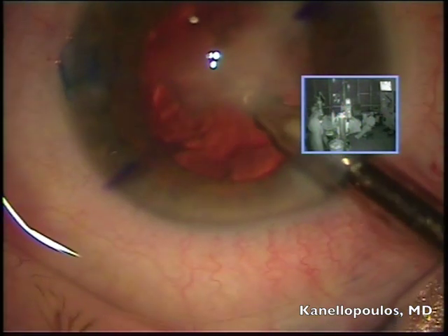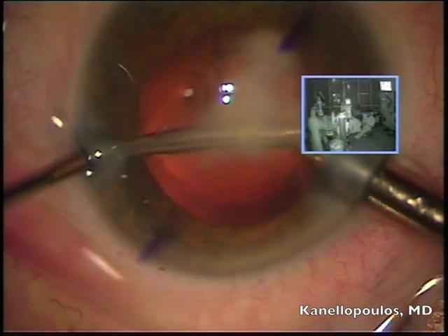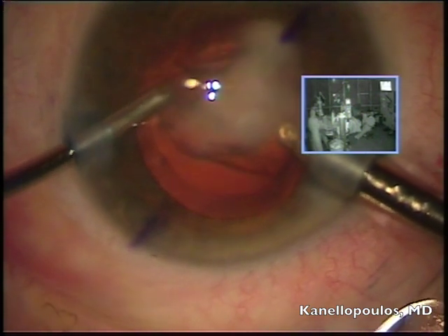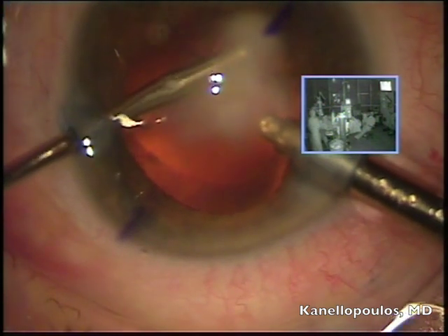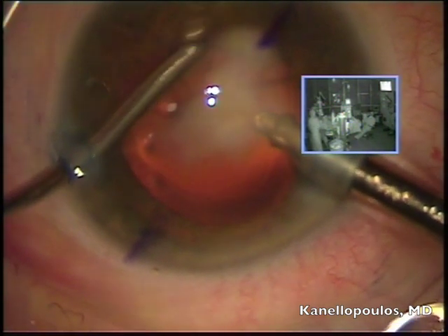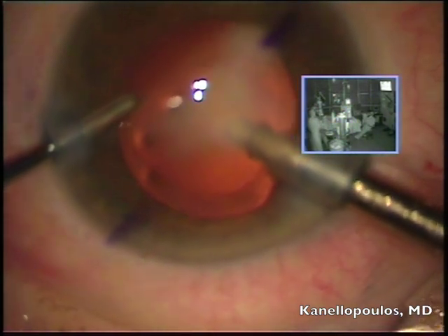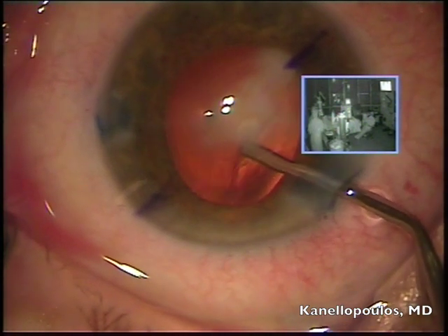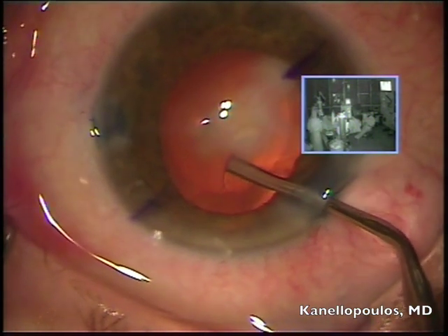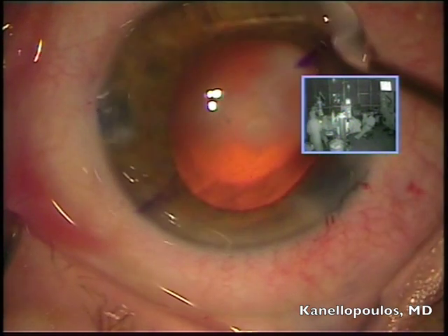I'm at the removal of cortical material. And again, some of the views here are very limited, working more habitually and with the red reflex visible at the borders of the central cornea scar. We're done with the cataract extraction and cortical removal. Methylcellulose here, we used Viscoat for the initial procedure to protect the endothelium as much as possible.